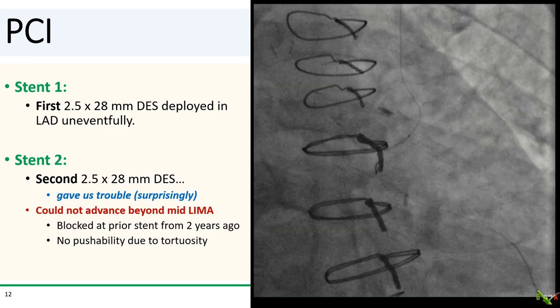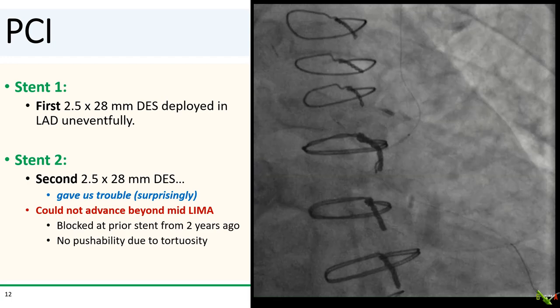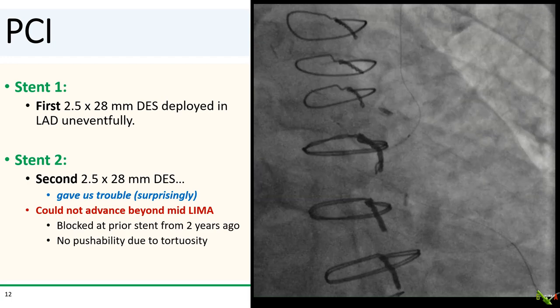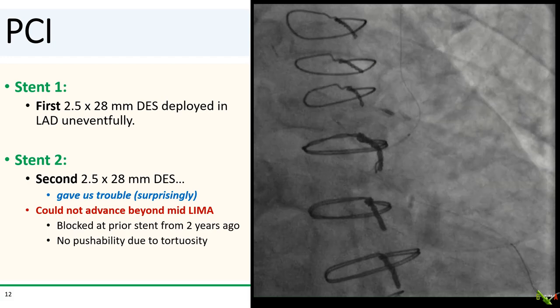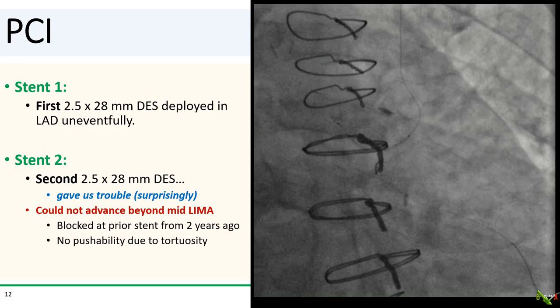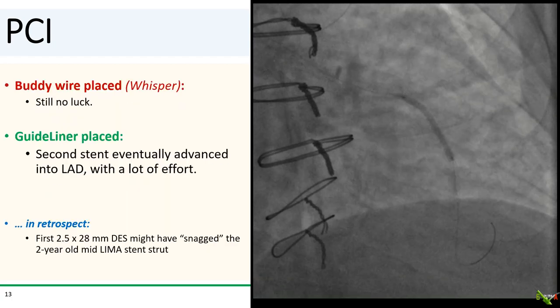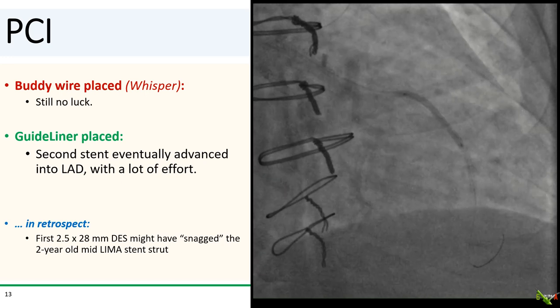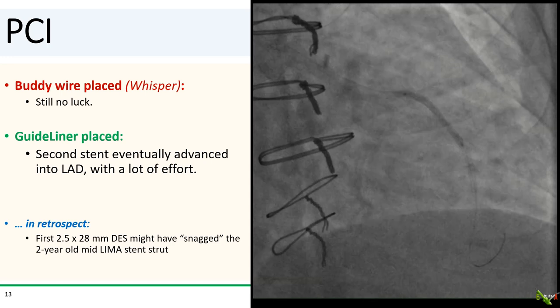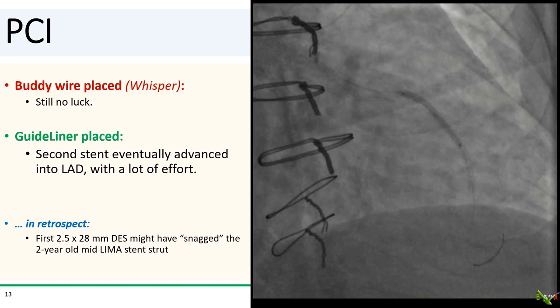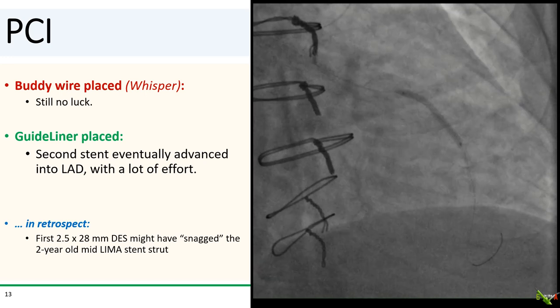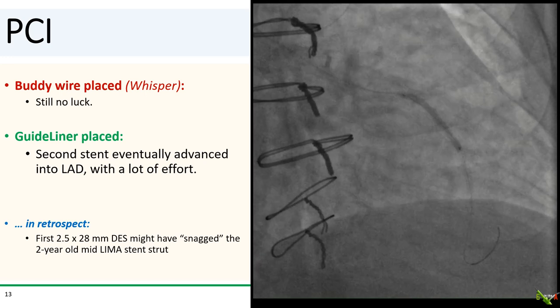We next tried to pass a second 2.5 by 28 mm DES, and to our surprise, this gave us trouble. Even though the first stent went by without any problems, the second stent got stuck in the mid-LIMA and seemed to be blocked by the prior stent from two years ago, with very limited pushability due to the tortuosity of the LIMA. We tried a buddy wire — still no luck. With a lot of effort, a deep-throated guide liner and some elbow grease, the second stent eventually passed and was deployed in the LAD. In retrospect, it is possible that the first stent snagged a strut from that two-year-old LIMA stent and blocked passage of the second stent. We thought we were close to being done — just a little post-dilation and we'd be finished.